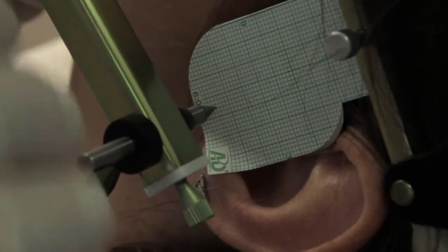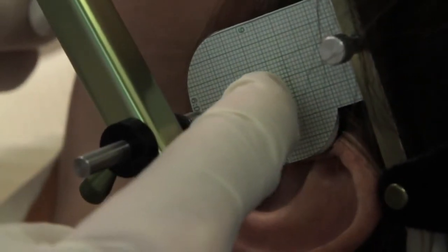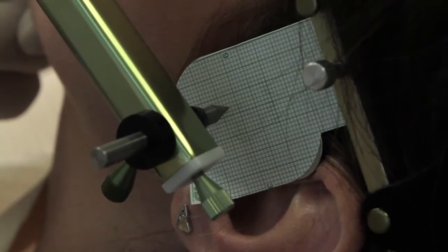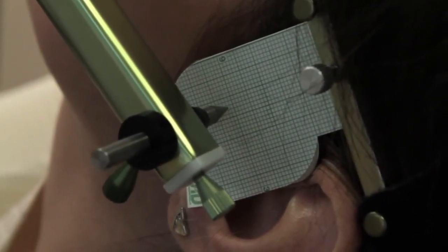It moves like this. That means the center of that circle is up here somewhere. So I'm going to start adjusting the vertical. But as I adjust the vertical, it comes forward some, so I automatically have to also adjust it posteriorly.